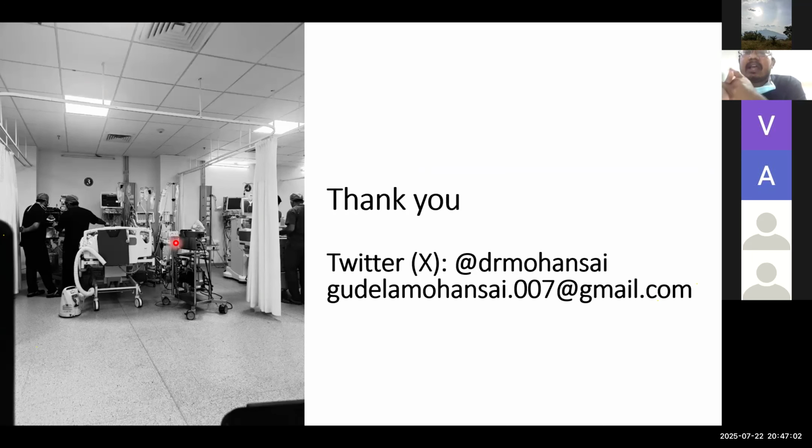And as they say, if you innovate, it's great. So we can use brain shock index for various tropical fevers or neuro infections to find out whether there is a cerebral hypoperfusion or not.